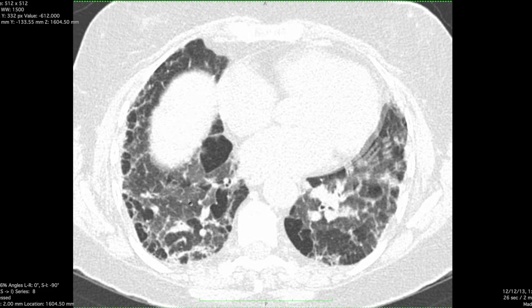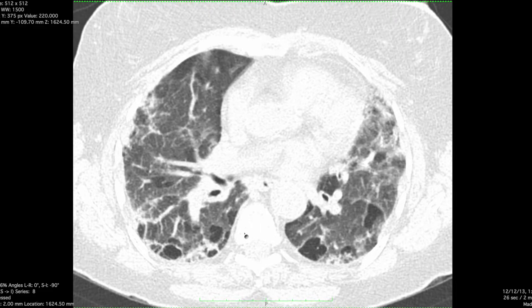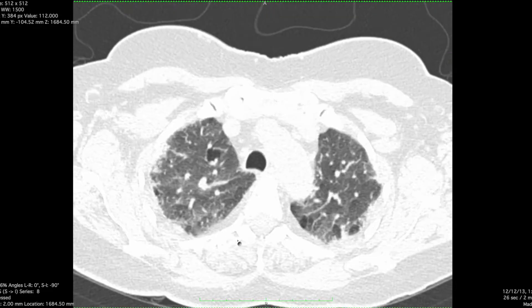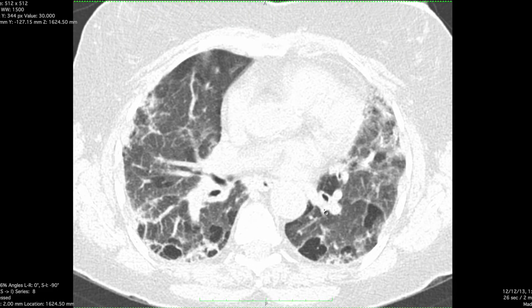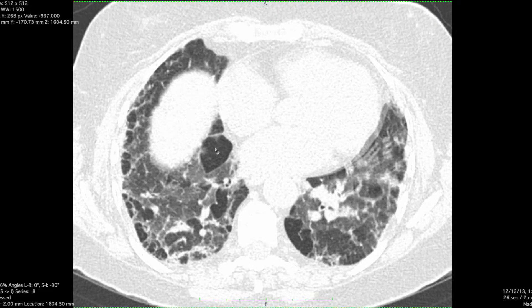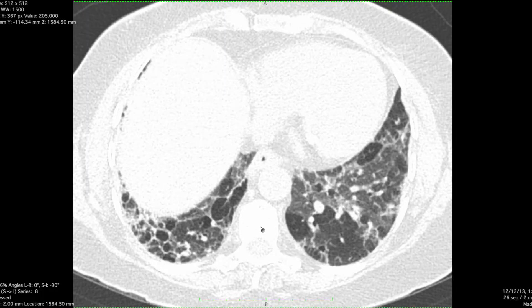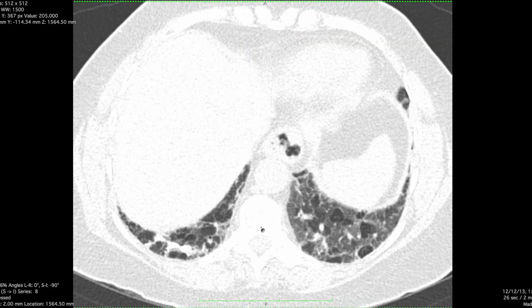Normal lung on expiration should turn more gray as demonstrated here. Other areas of air trapping will stay equally as black as they were on the inspiratory series. So there's a lot of air trapping here — a ton of secondary pulmonary lobules, some of which are coalescing into each other, demonstrating these areas of air trapping.